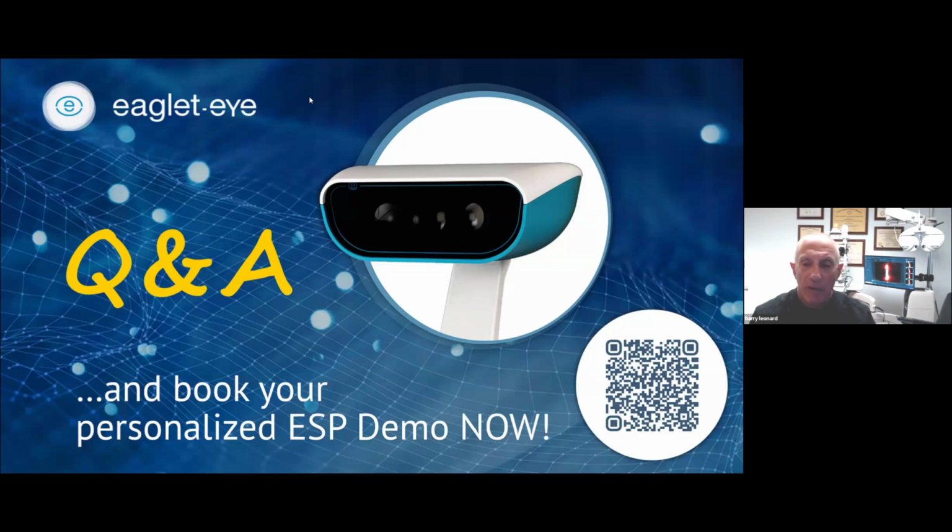So the others, I don't know for any of you that were at ICSC a month ago or so in San Diego, they did a good presentation about washout, and it was sort of eye-opening, no pun intended, because we've always sort of said, hey, let's do this 3 or 4 or 5 day washout. And I forget who it was that did a study. They showed same day eaglet, 1 day washout, 2 day washout, 3 day washout, and how it wasn't changing as much as we would hope it was.